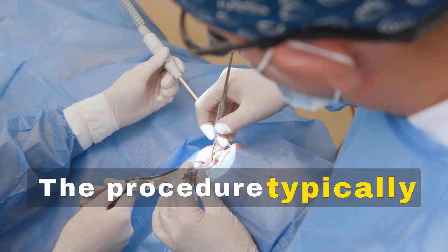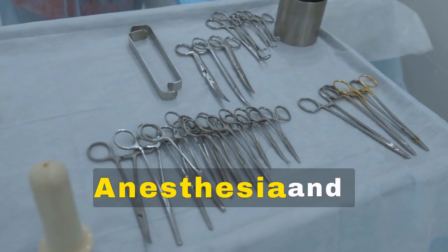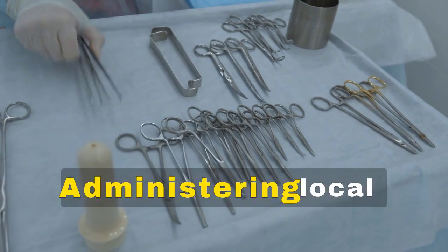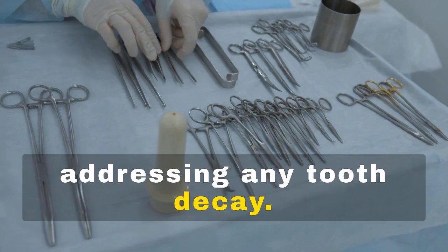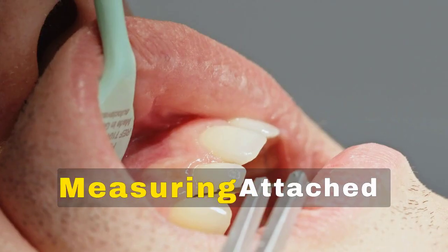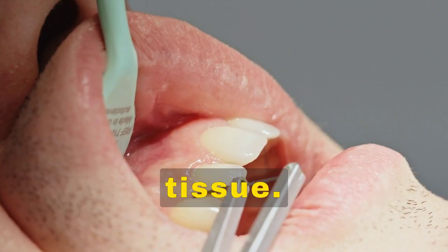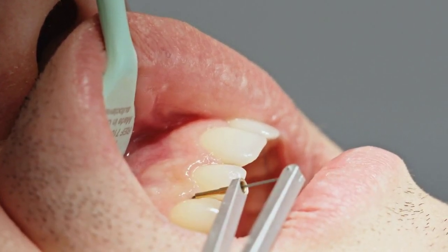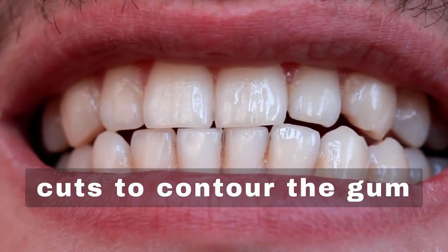The procedure typically involves anesthesia and caries removal, administering local anesthesia and addressing any tooth decay. Measuring attached gingiva, assessing the width of the attached gum tissue. Gingival incisions, making precise cuts to contour the gum tissue.